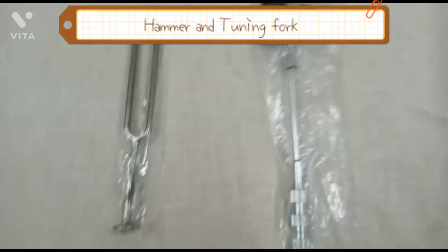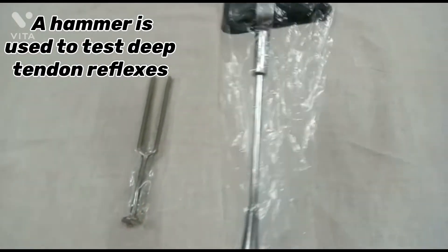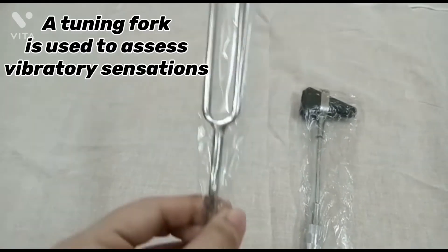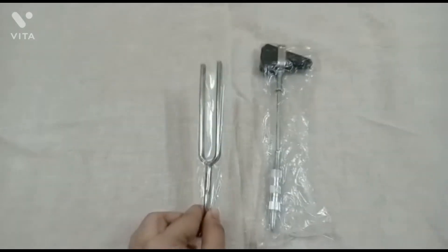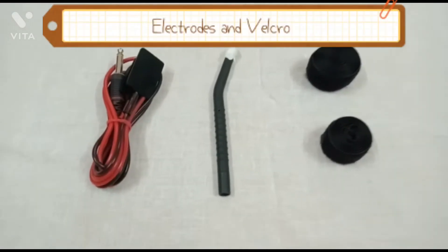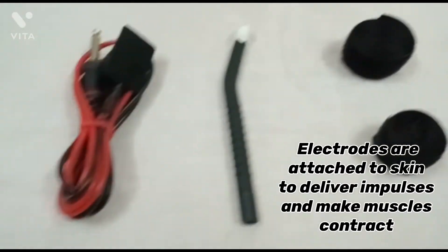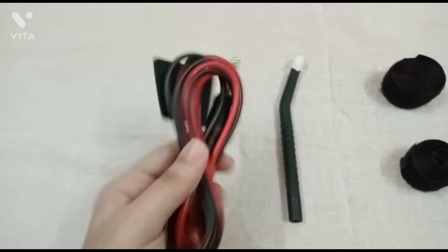Next are the hammer and tuning fork. The hammer is used to test deep tendon reflexes. The tuning fork is used to assess vibratory sensations. Electrodes and Velcro — electrodes are attached to the skin to deliver impulses and make muscles contract.